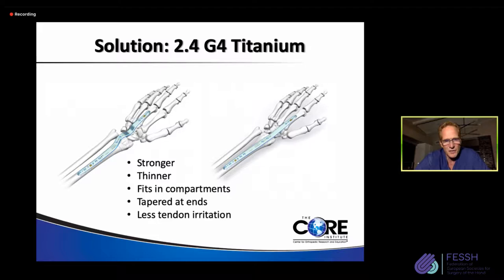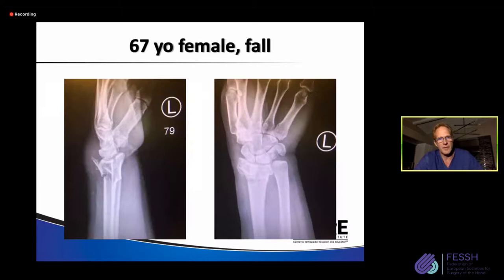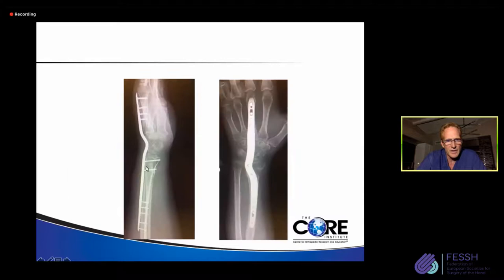Here's a 67-year-old female who fell. Mostly my focus is going to be on this dorsal lunate facet. I'm also going to be a little concerned about this volar fragment right here. How am I going to control that with just a spanning plate? I certainly can put some fragment-specific fixation here. But instead, because the Medartis plate allows me to do this, I can lag that fragment into the plate and even lock it in place if I need to. And so it saves me making another incision here and putting a fragment-specific plate on that for added security.